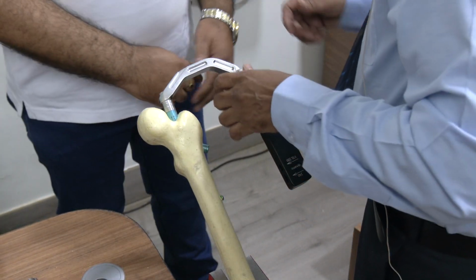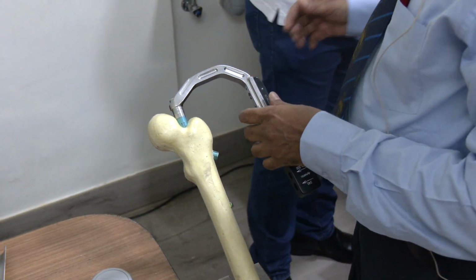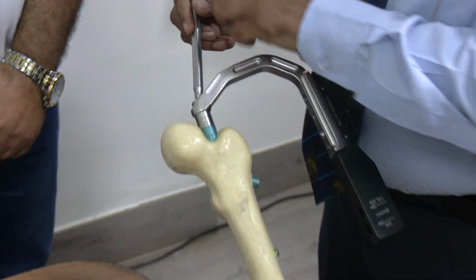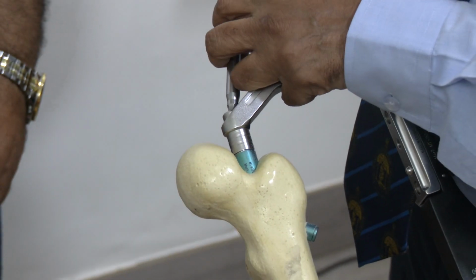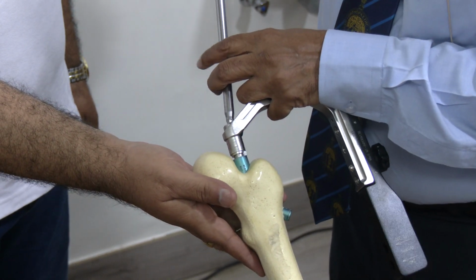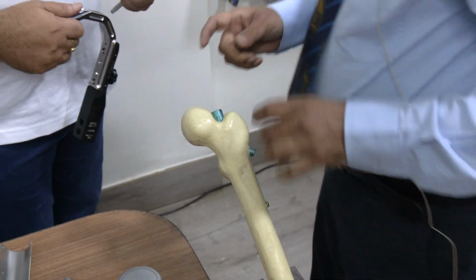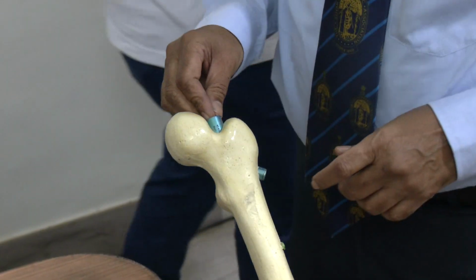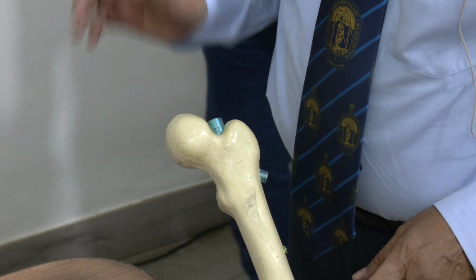Now set screw or end cap. I'll remove the jig attachment. For removal of the jig, you can see that the T handle I am using can be put at any different angle which is convenient for the surgeon, and take it out. So that's the usefulness of this instrument. And at the end of the surgery we put an end cap. So the end cap is not there today. So you can put an end cap so that bone overgrowth can be prevented.